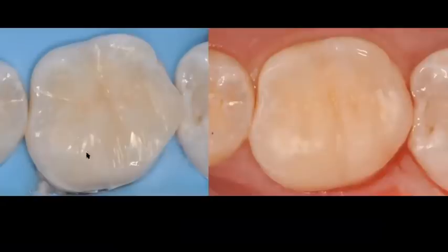And then I just go ahead, remove my rubber dam, start my finishing and polishing, remove any excess, do my final contours. And you can see how natural the occlusal anatomy is. We were able to achieve such a natural occlusal anatomy with very, very little effort and very, very little rotary instruments being used. Again, occlusal adjustment is simplified using this technique.